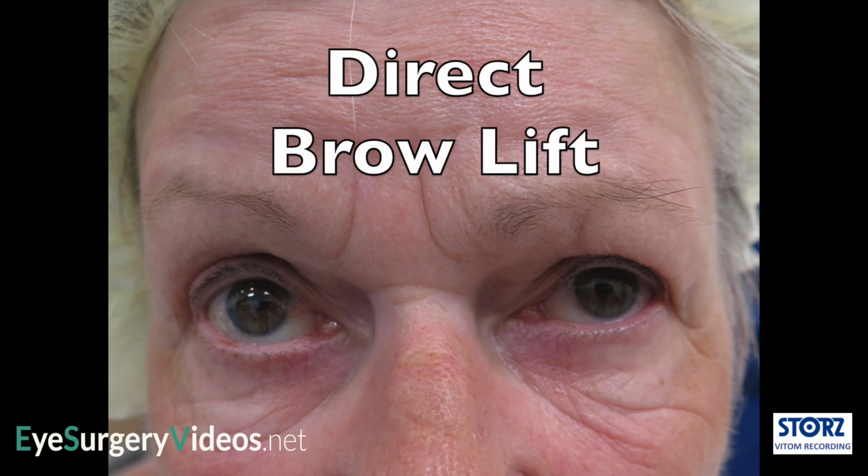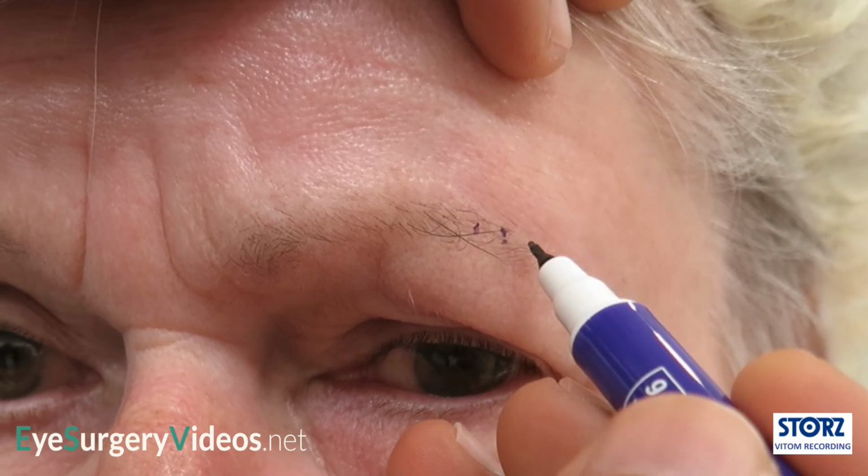This patient has a paralytic brow ptosis from a long-standing partial lower motor neuron 7th nerve palsy. The skin is marked with the patient upright.